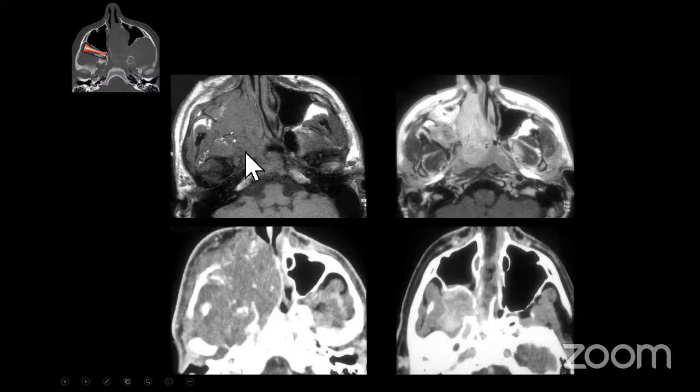Now, this is without contrast, but I did it without contrast just to emphasize the aggressive bone erosion that's involved in the posterior wall of the maxillary sinus. And then when you look internally, there's no flow voids. It's very, very bland. So this is your rhabdomyosarcoma.